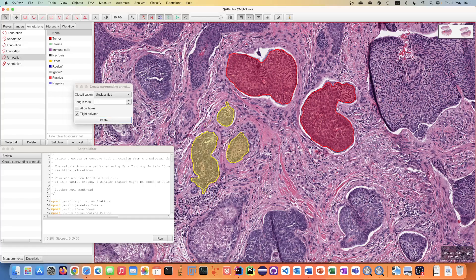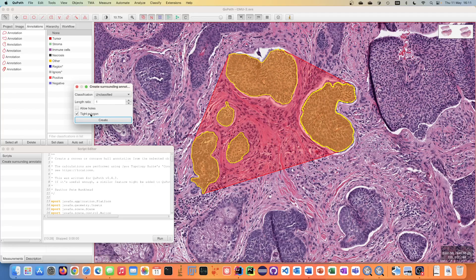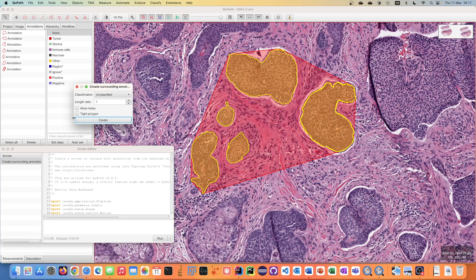If I select more, all of them should be considered. And if I turn off this Type Polygon option then basically what I get with the default settings is the convex hull around all of these annotations.